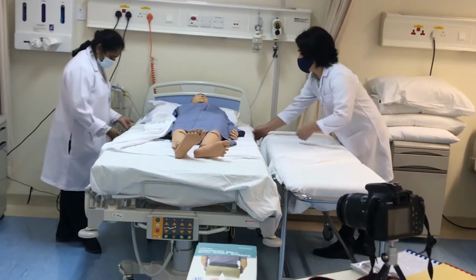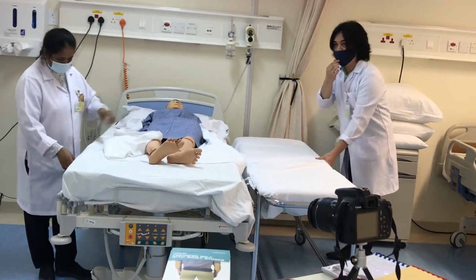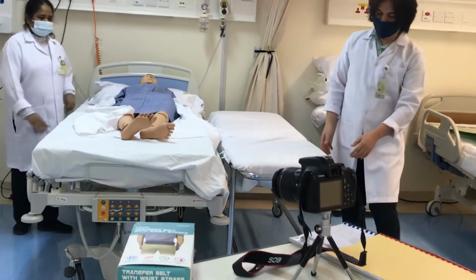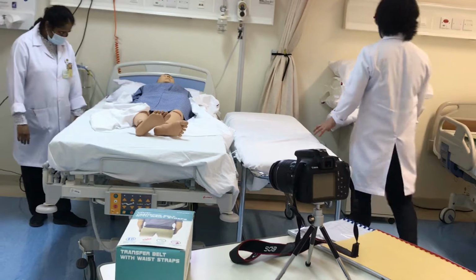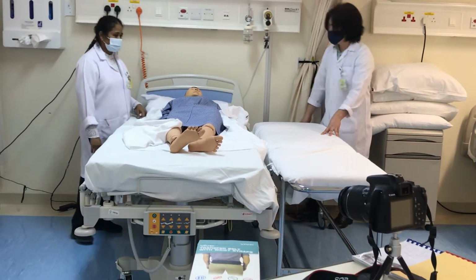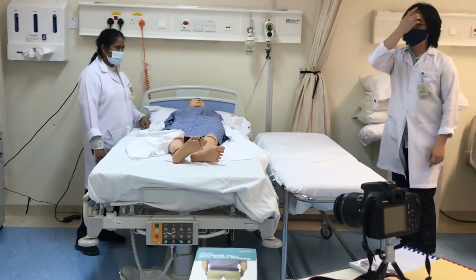And make sure you have the turn sheet here. And make sure to put the stretcher parallel to the bed. And make sure it is locked. Where's the lock? There's a lock here. It will not move. So this is very important.